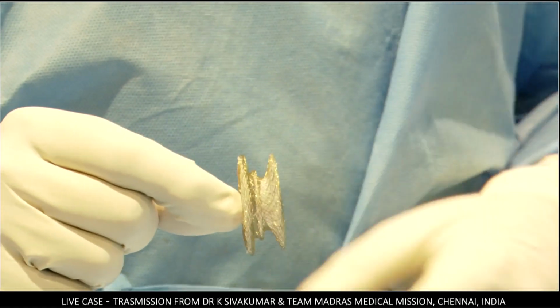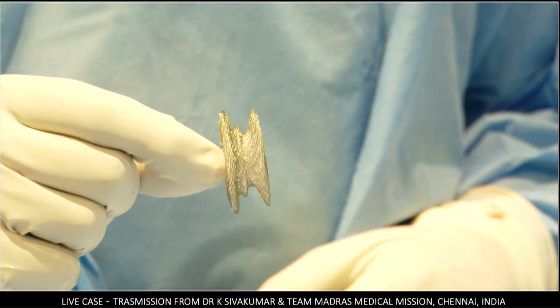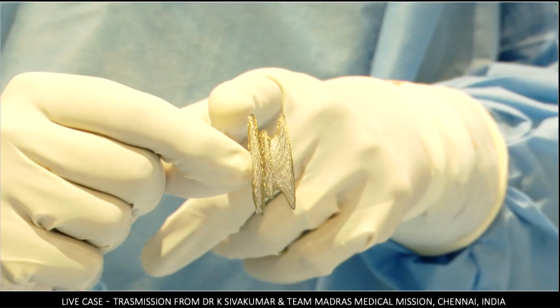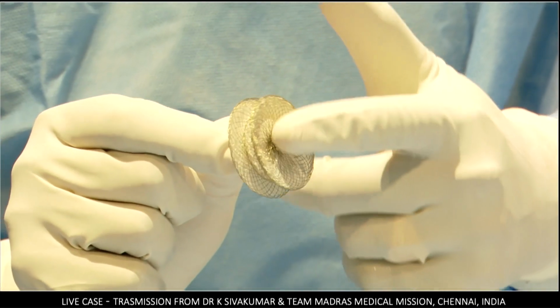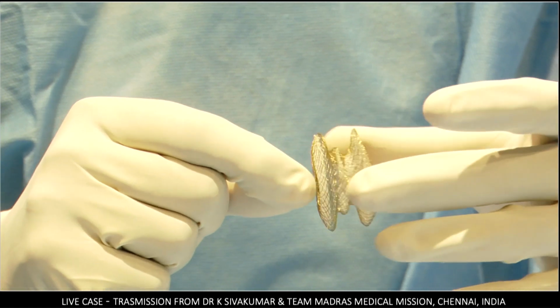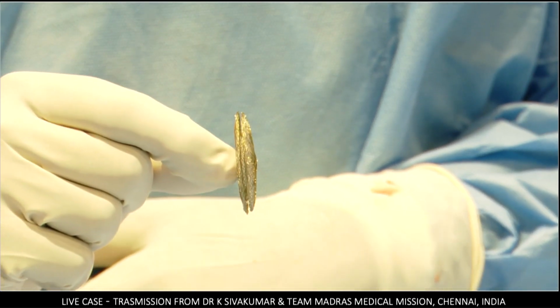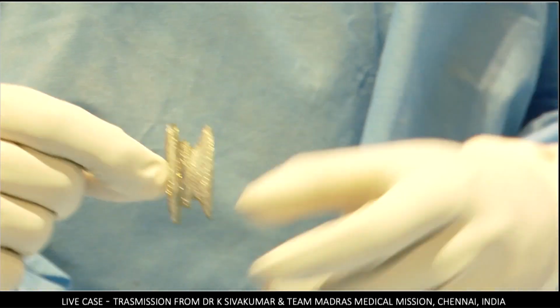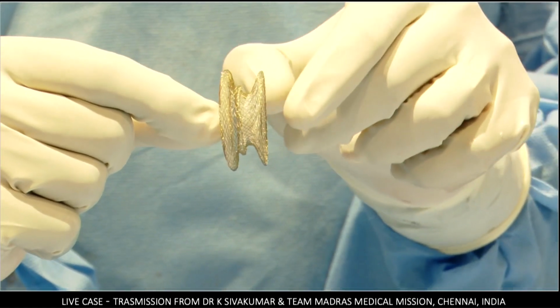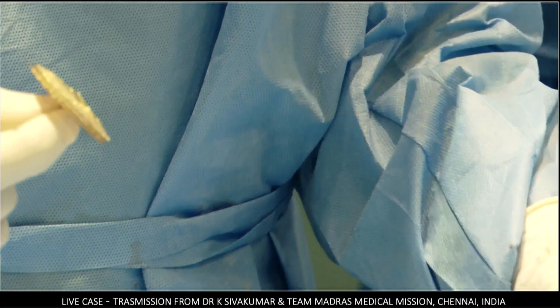It opens out. I was shown one of the pictures from Vietnam, a fluoroscopic image in an LAO projection where the two discs were slightly separated. And now I can understand why it is so. If the left atrial disc becomes concave, this becomes slightly separated. But if it is flat, the device regains its memory. So I'm thinking that if after deployment the device gets this profile, I probably might push the cable a little bit and see what happens. So let's see how the device behaves in real life.